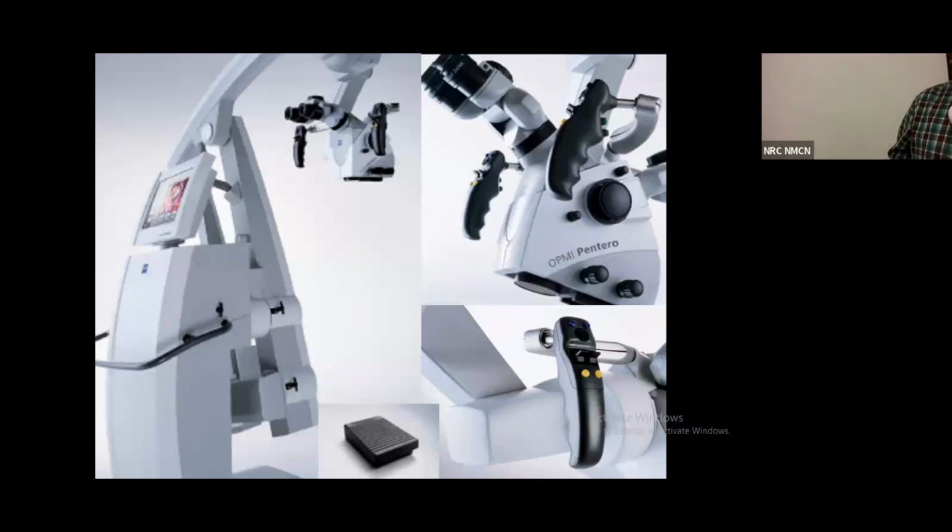These are the handles that the microscope has. It has two handles. One of the important functions you can understand is to move the microscope from one angle to another. But apart from that, you can see there are multiple small buttons out here. The two most important functions of the microscope are to focus and to magnify. So these buttons primarily provide for magnification, for zooming, dezooming, and to focus near and focus for distant objects.